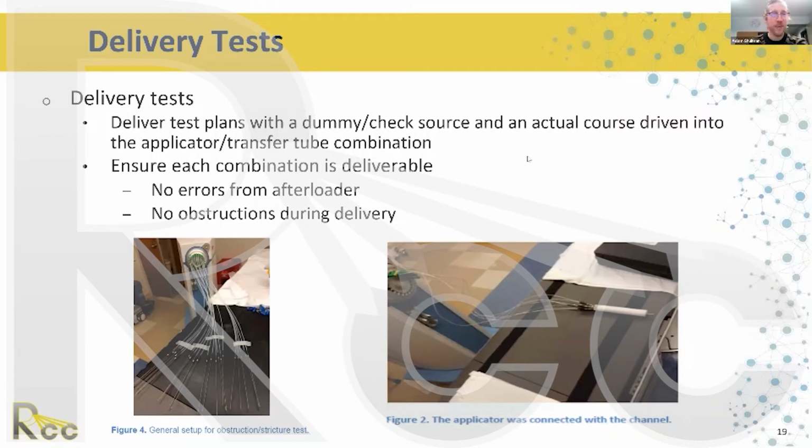Sonja, speaking of wear and tear, we've got a good question, if you don't mind answering. Sure. Trying to answer. What is the clinical lifetime for transfer tubes or for applicators? I think I have a slide on that later, but just to say, the manufacturer usually specifies what they consider the lifetime limit. I've just changed manufacturers, so my memory can be for either one of them. I think one of them specified 5 years for the transfer tubes. The other one specified a number of sterilization cycles.